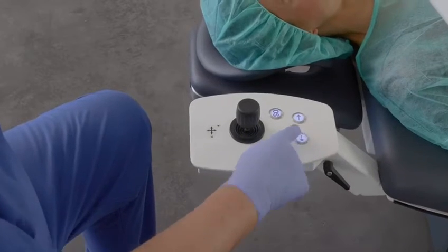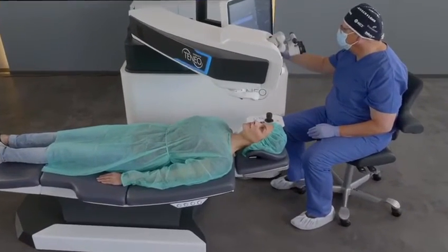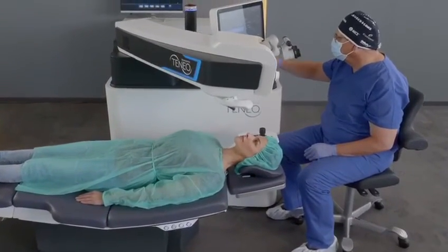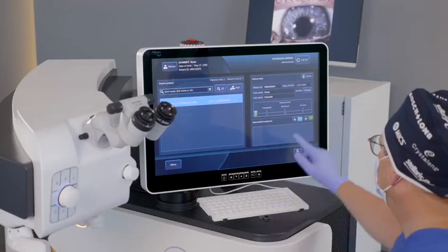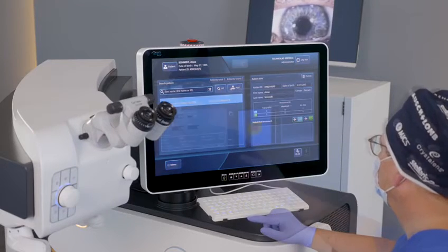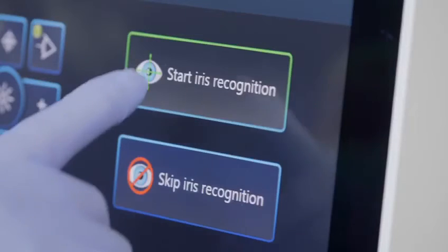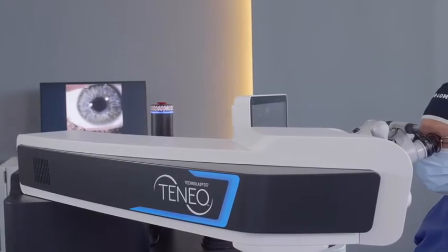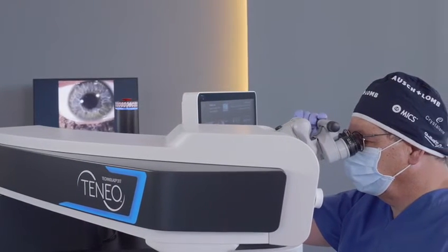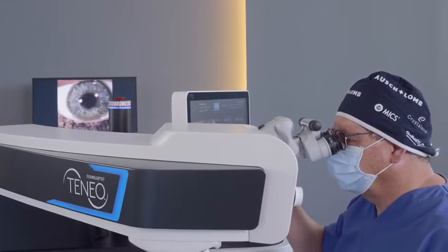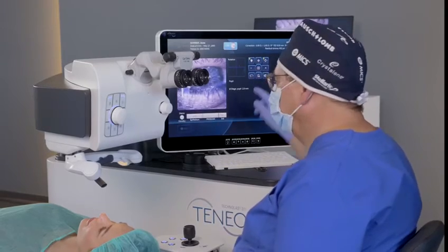The latest Technolas Teneo Model 2 software enables fluent data communication with ACE and provides multiple ease-of-use advancements, helping to optimize the daily workflow while assisting custom treatments. Teneo Model 2 recognizes the patient via iris recognition. The integrated cyclotorsion compensation helps to align and deliver the laser treatment to the intended position of the eye.